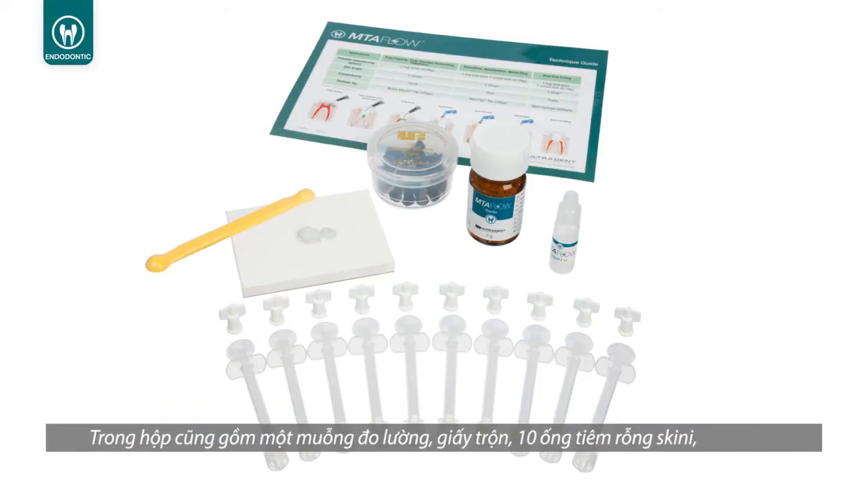The kit also includes a measuring spoon, mixing pad, 10 skinny syringes, 10 luer lock caps, and 20 black micro tips.